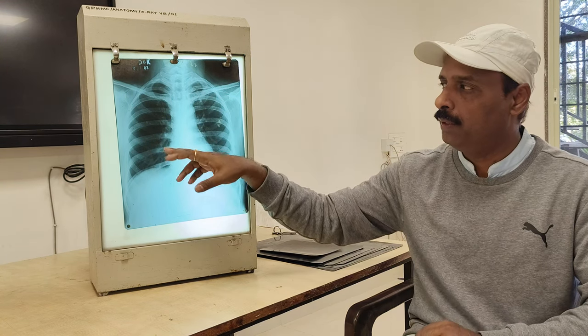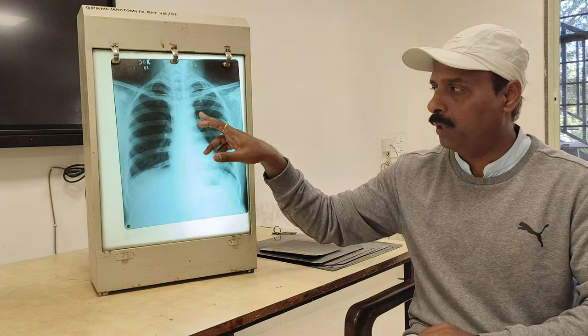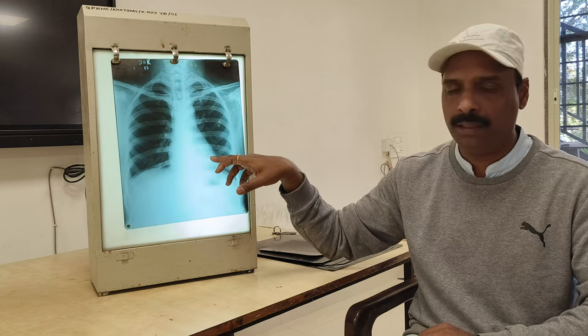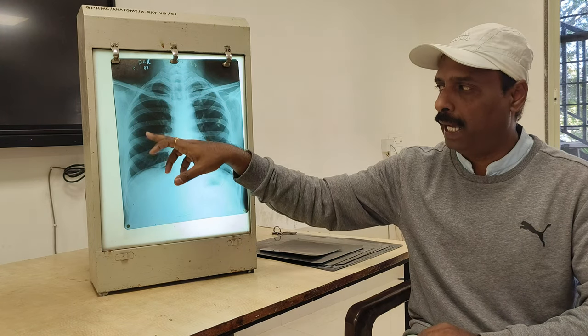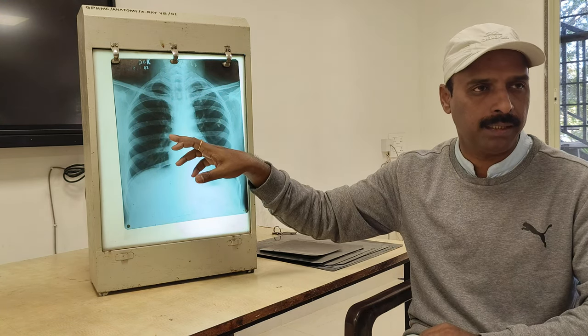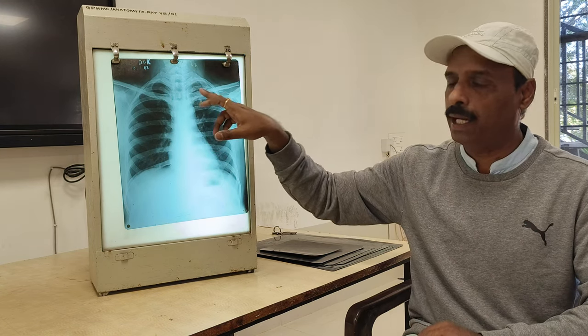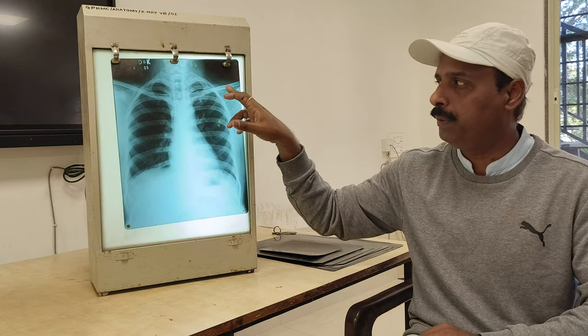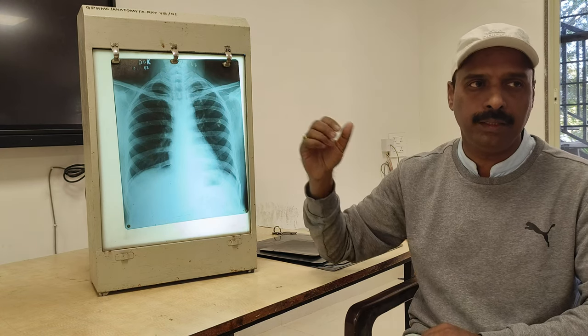And how they give the different shadows: you are going to get a hard shadow filled with the liquid, a whitish shadow. Then the lungs are seen black because they are filled with air, so that is a blackish shadow we are going to get. All the bones are also seen in a light, bright color. So you have to identify the shadows of the different structures of the body. This is how to read the PA chest.